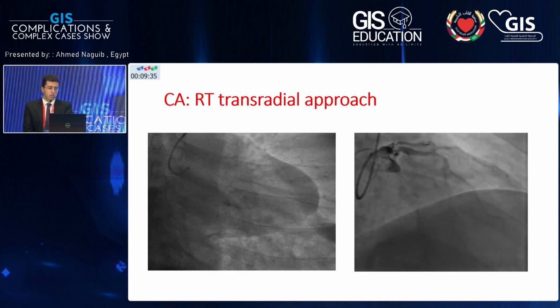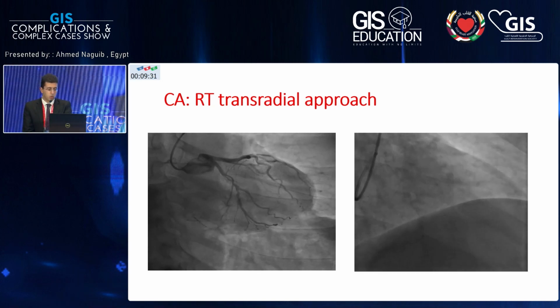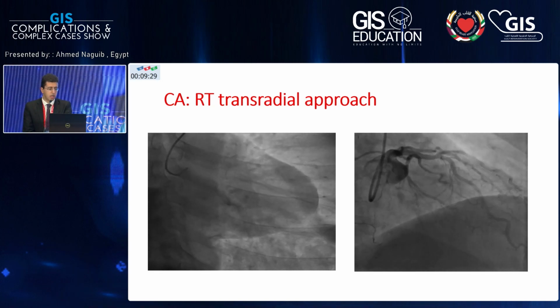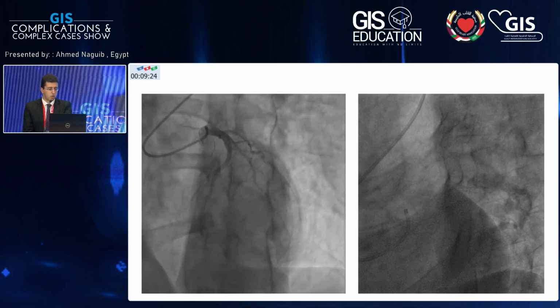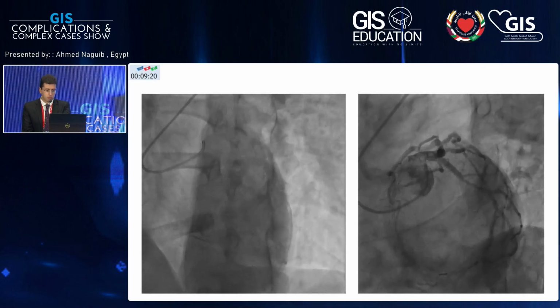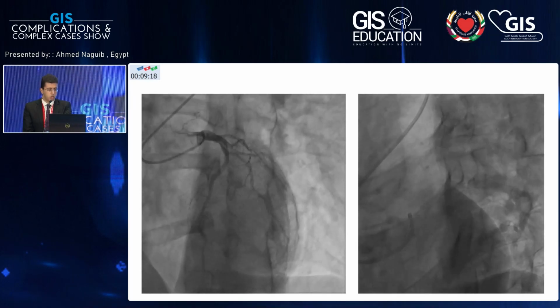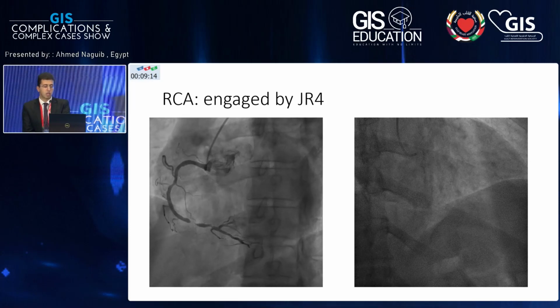Start with the coronary angiography. The LAD shows a non-significant atherosclerotic lesion, and there is an intermediate lesion in the mid-LCX at the bifurcation with a marginal. This is a spider view. There is a bifurcation lesion, and then the RCA, there is a tight subtotal occlusion of the distal RCA.